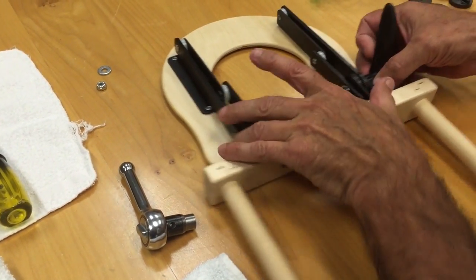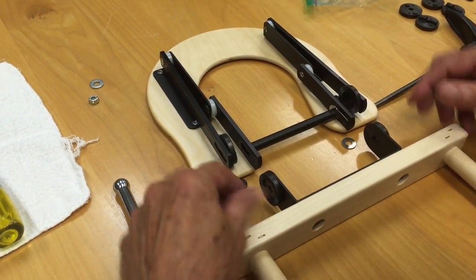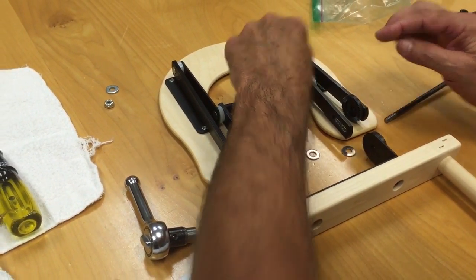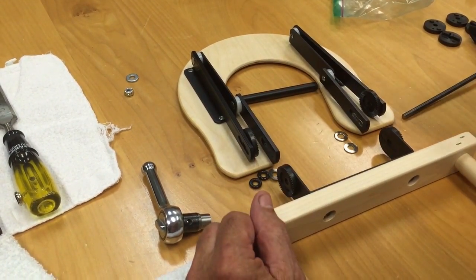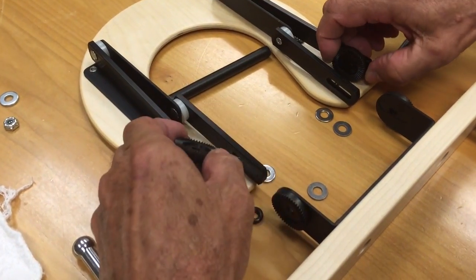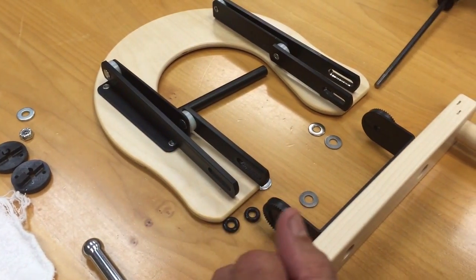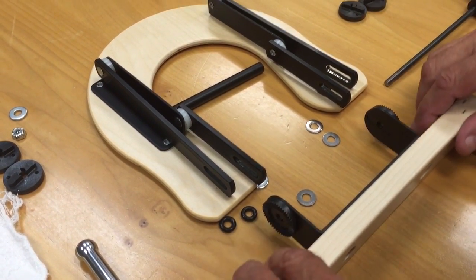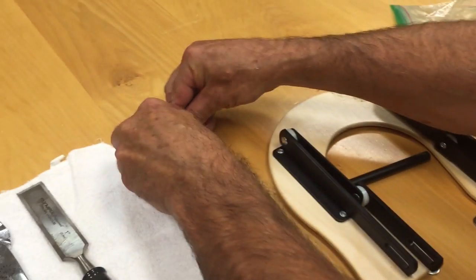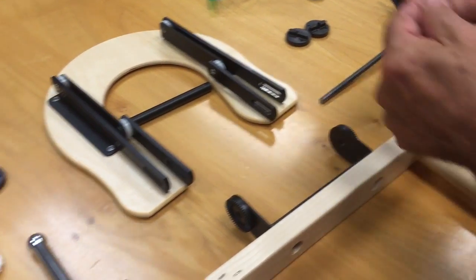When you slide your rod out, you'll notice the 2 O-rings are between the discs on each side, and then you have a bar with 2 same thickness washers, as well as on this side. Set your old discs to the side that will be replaced with the 2 new from the kit. Then take your O-rings, set them aside as well, and your 4 stainless steel washers.